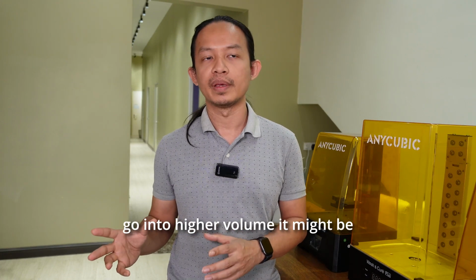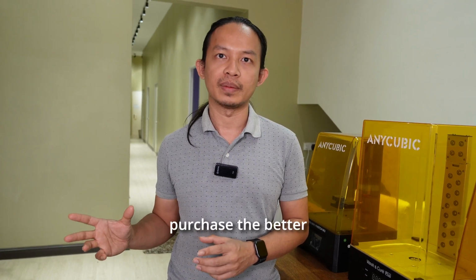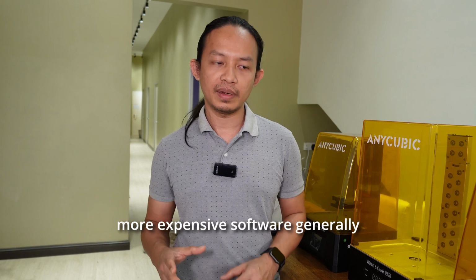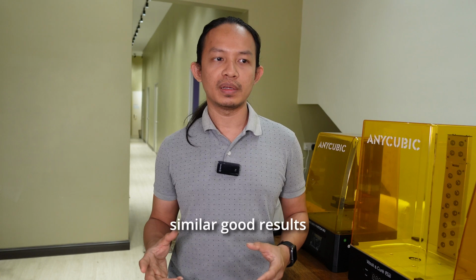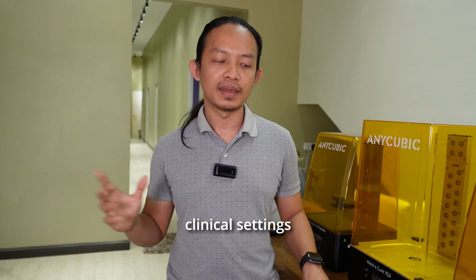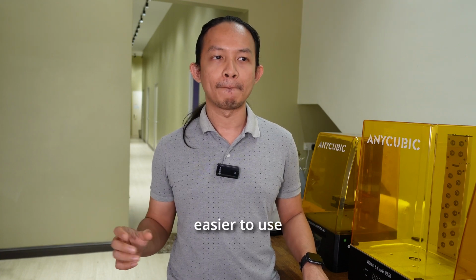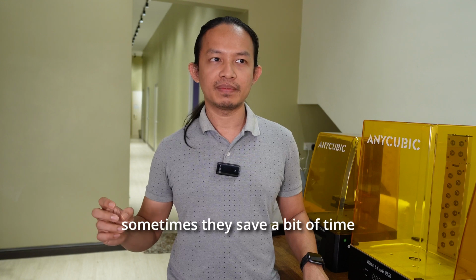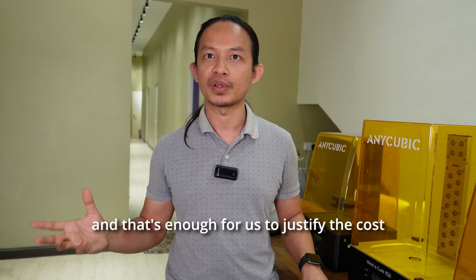When you go into higher volume, it might be advisable to purchase the better, more expensive software. Generally, they can output similarly good results, perfectly fine for a clinical setting. It's just that the more expensive software is a lot easier to use. Sometimes they save a bit of time, and that's enough for us to justify the cost.